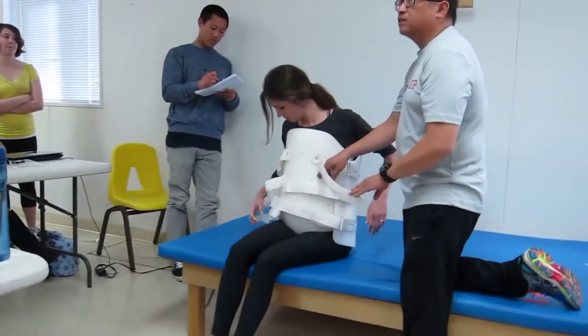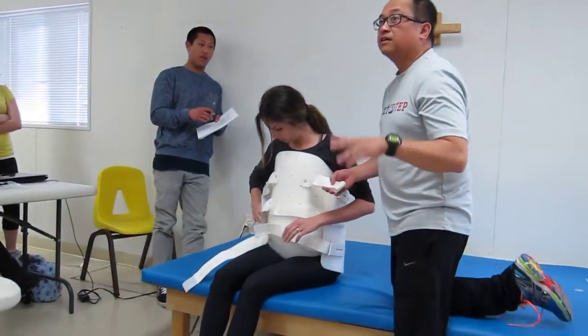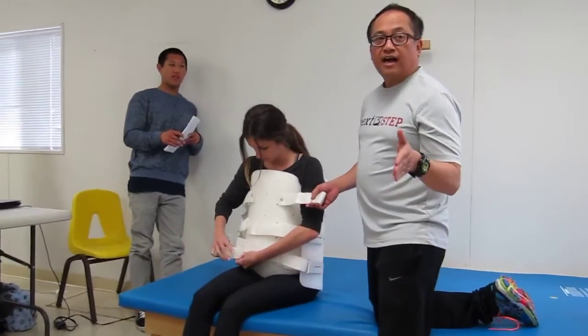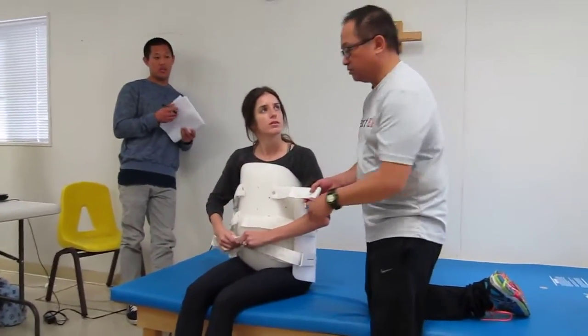It's a lot easier to apply the TLSO, obviously, when the client's sitting at the edge of the bed, but you will have to determine whether or not that client has the trunk stability to do it.